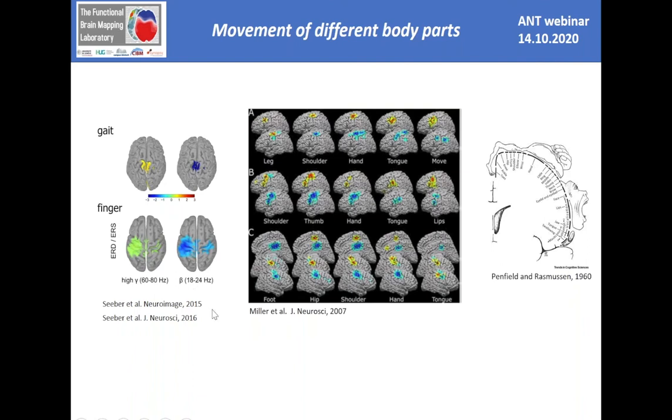And we can compare this to a different study who did the same mapping procedure, but for ECoG, meaning intracranial recordings using grids, but also doing mapping, but not non-invasive. So these non-invasive patterns I was observing here are beautifully matching with these invasive mapping techniques, right?